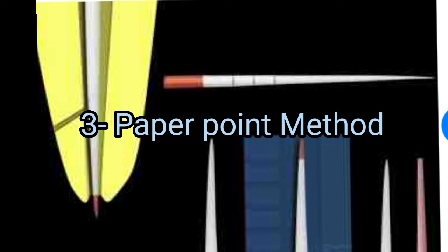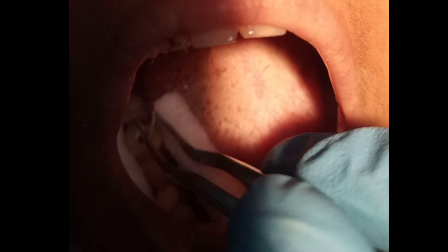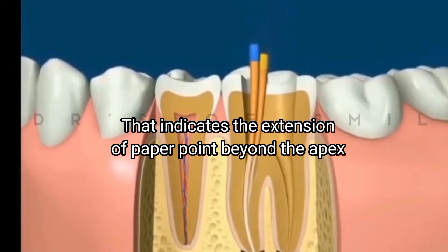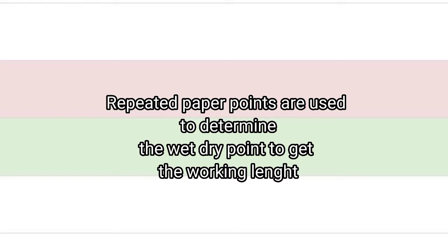Paper point method. This technique is based on the principle of the wettability of the paper point. This technique includes placing a paper point in a dry canal 1 to 2 mm shorter than the working length determined by the electronic apex locator. If the point is dry, advance the paper point until it is just moist. A minute amount of blood or tissue fluid at the end of the paper point is an indication that the paper point has been inserted beyond the foramen. Repeated paper points are used to determine the wet-dry point to determine the working length, that is from the occlusal level of the tooth to the apex of the tooth.